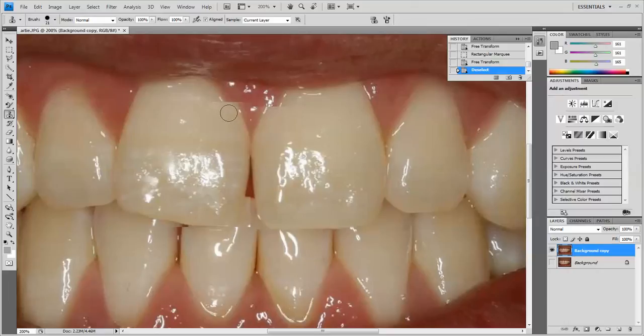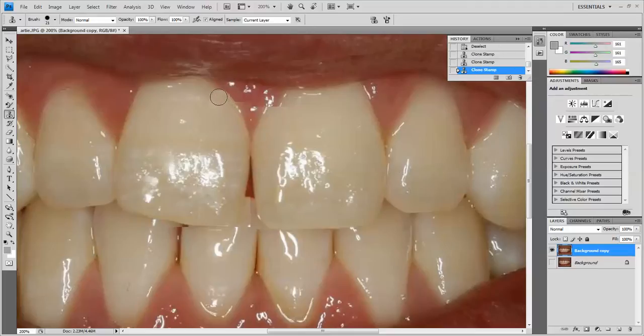Let me show you how I would smooth out the gingiva here. I would get right here, alt-click, and now I'm going to start clicking my way around, smoothing this out.